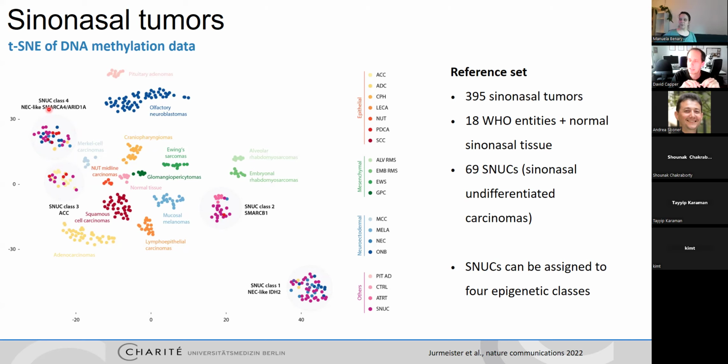And what we can now very easily do, and we actually did this just a few weeks ago, is look at this specific promoter across all types of methylated tumors that we have analyzed in the past. Meaning that coming from this data, we can predict if there are other types of cancer that may also benefit from such a specific chemotherapy. Maybe it goes in this direction.